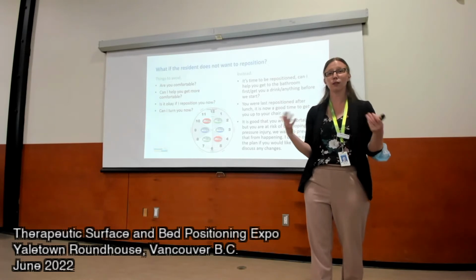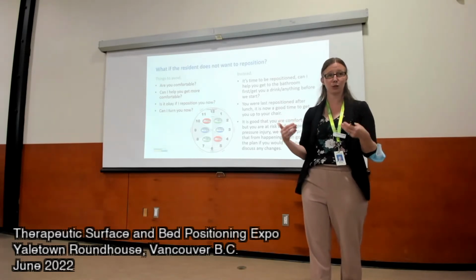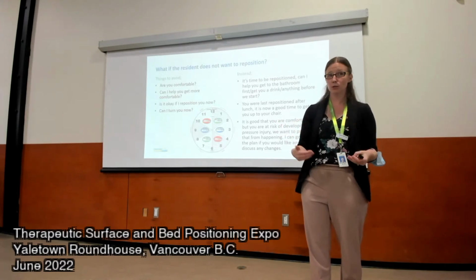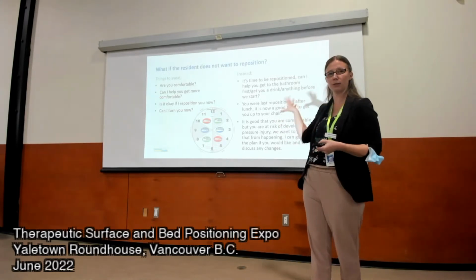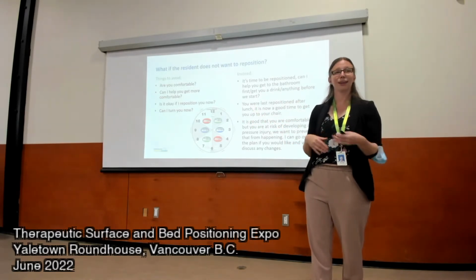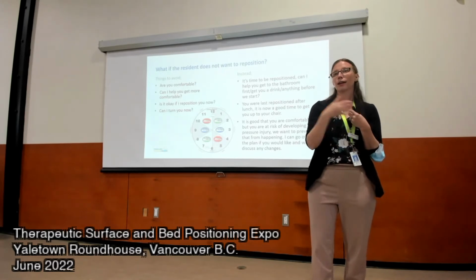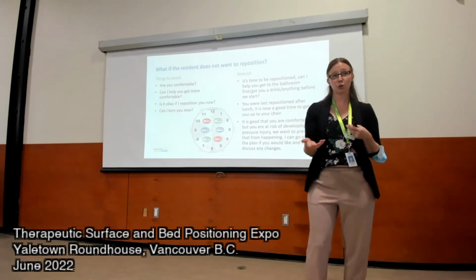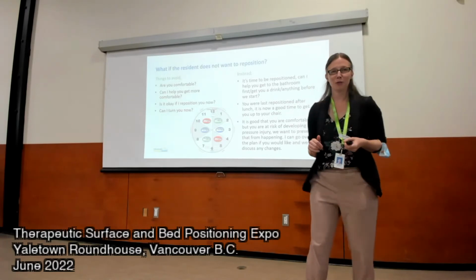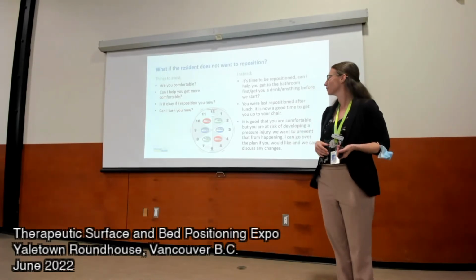We need to look at the different occupations that they want to be doing and make sure that they are able to still do those things within their repositioning schedule. So you can move the bed so that they can still watch TV or visit with a friend. If I'm going to be repositioned and I'm going to look at the wall for the next 2 hours, I probably don't want to be repositioned.